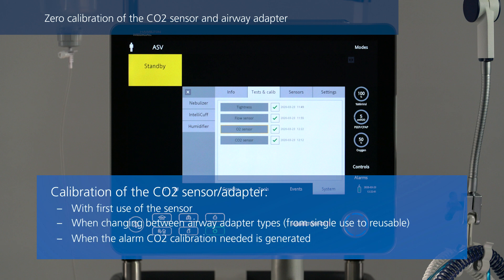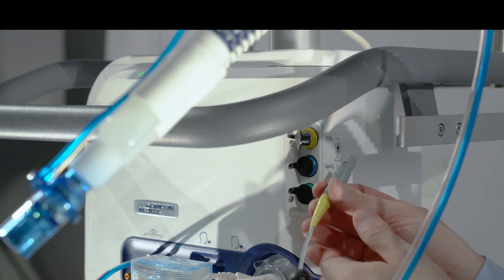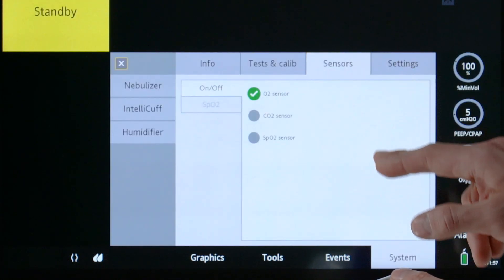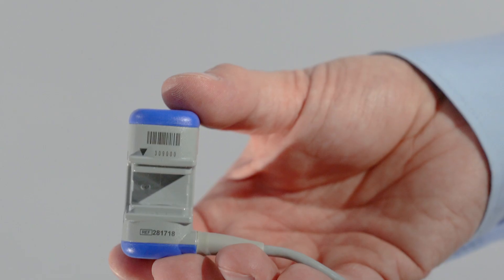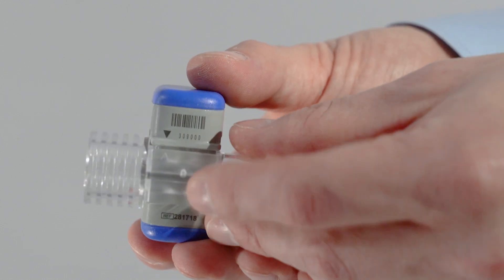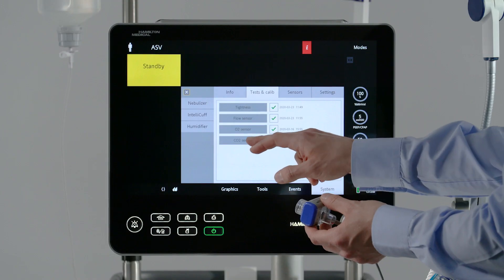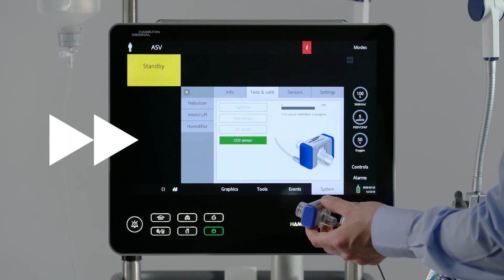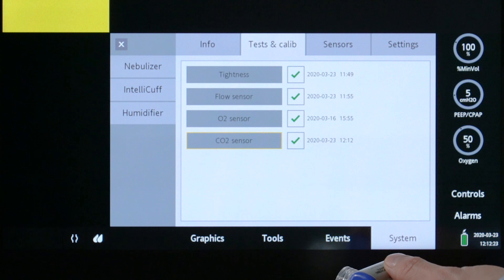As CO2 sensors are already calibrated at the factory, you only need to zero calibrate the airway adapters. Connect the sensor to the ventilator and check if CO2 monitoring is enabled. Wait approximately 90 seconds for the device to warm up. Connect the airway adapter to the CO2 sensor and keep these components away from all sources of CO2 and the exhaust port of the expiratory valve. Do not move the CO2 sensor during zero calibration. When zero calibration is complete, make sure there is a green check mark in the CO2 sensor checkbox.